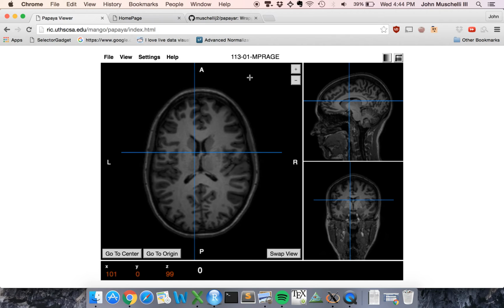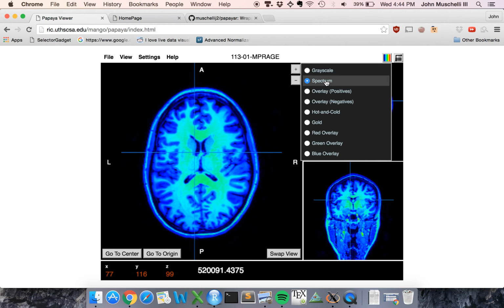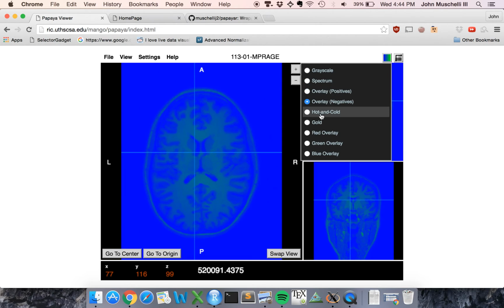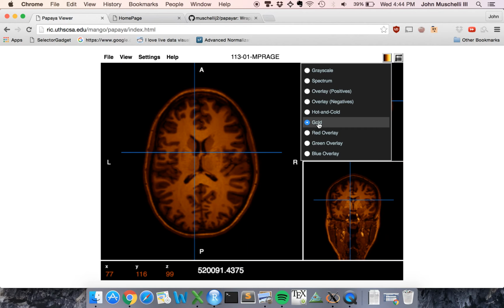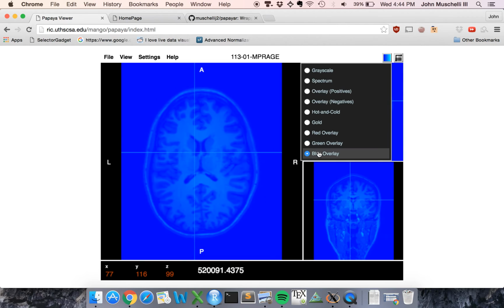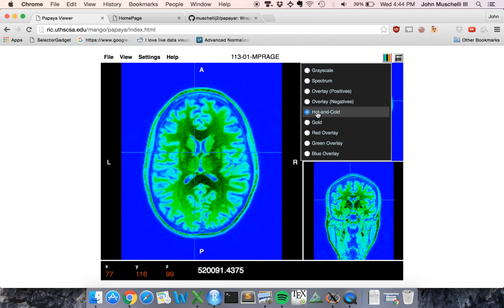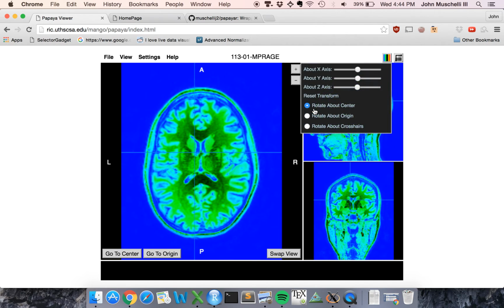And again, I would use these for interactive viewing. I wouldn't necessarily use them for figure generation unless you made a really good figure, for example, and you couldn't figure out how to do it in R, but it was super simple how to do it here. So there's other fun overlays. Again, when we looked at the histogram, this histogram is a little bit wide or long, I guess, in some respects.